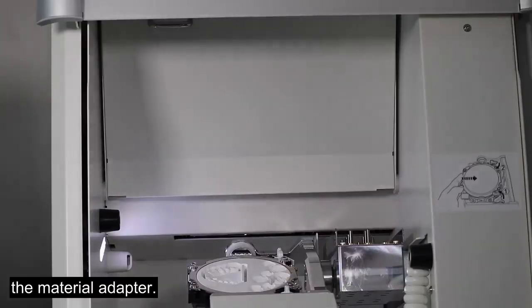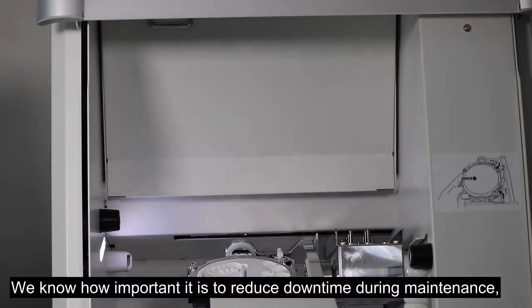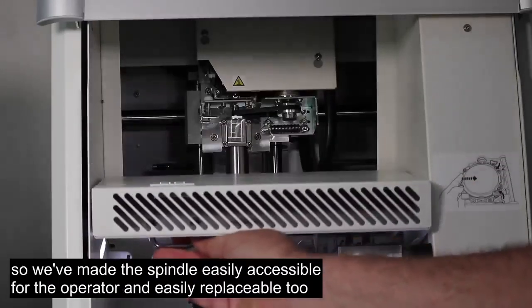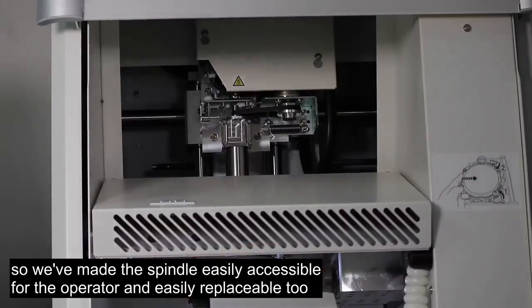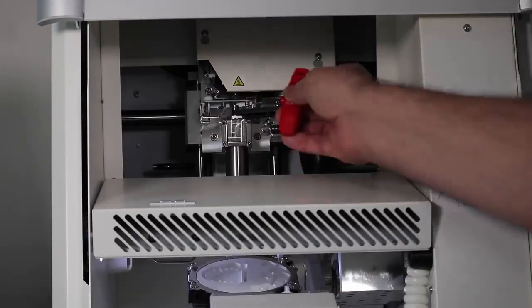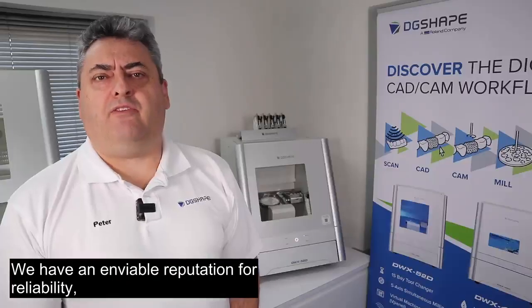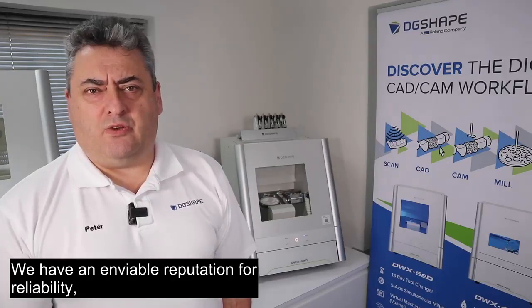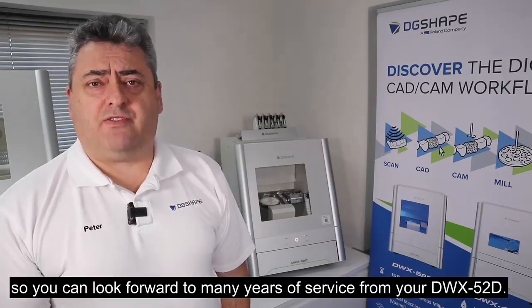We know how important it is to reduce downtime during maintenance, so we've made the spindle easily accessible for the operator and easily replaceable. We have an enviable reputation for reliability, so you can look forward to many years of service from your DWX-52D.